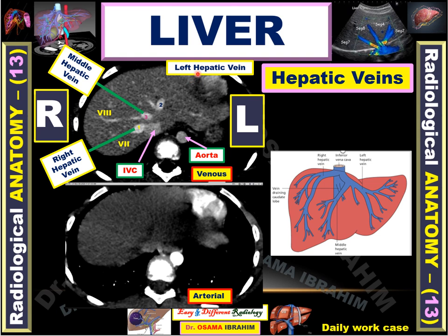The left hepatic lobe is divided into two segments: medial and lateral. The medial segment is segment IV, and according to the level — since this is the upper level — this is segment IVA. The lateral segment, which represents the lateral border of the liver, is segment II.